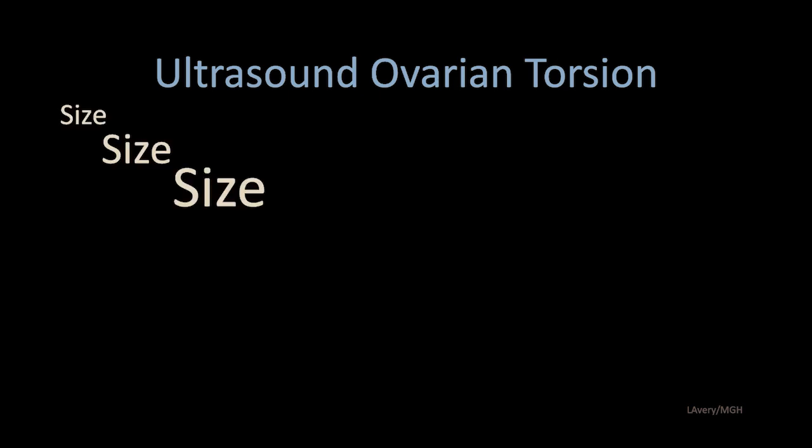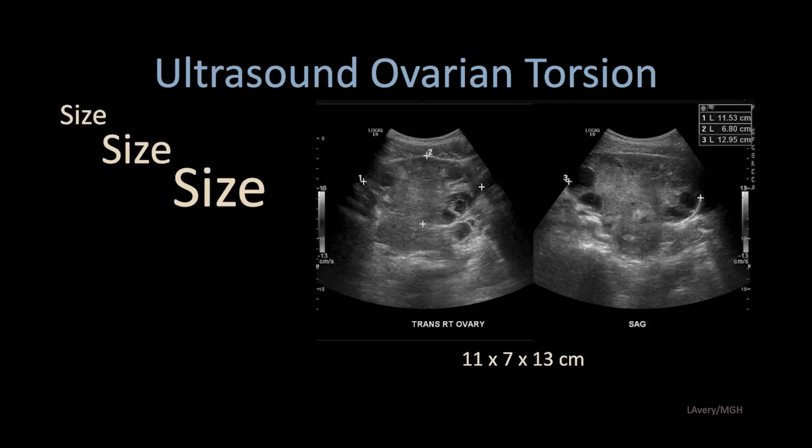Let's discuss the ultrasound findings of ovarian torsion. Size is very important in evaluating for ovarian torsion. Here we see an extremely enlarged edematous ovary measuring 11 by 7 by 13 centimeters — volumetrically, that is enormous. Any ovary over 4 centimeters should be considered as possibly torsed, especially if asymmetric from the contralateral side.